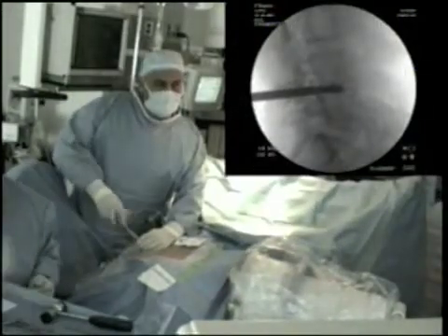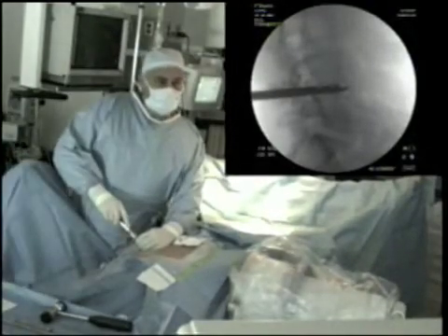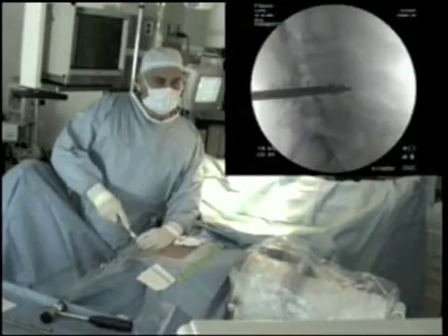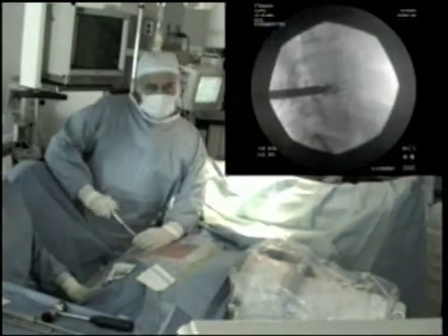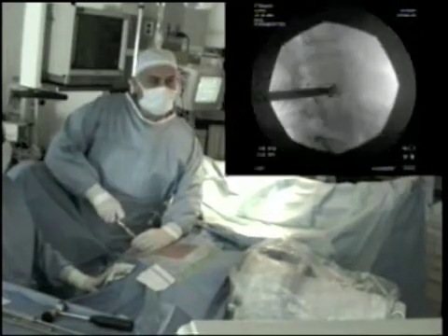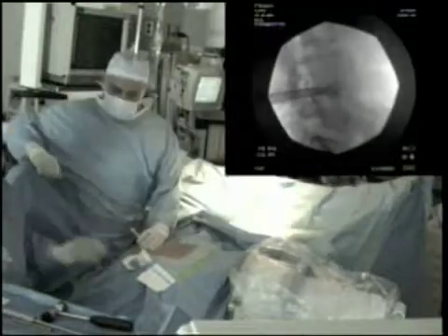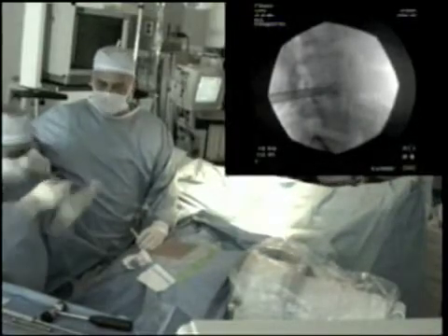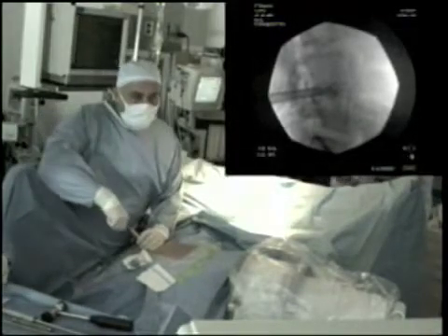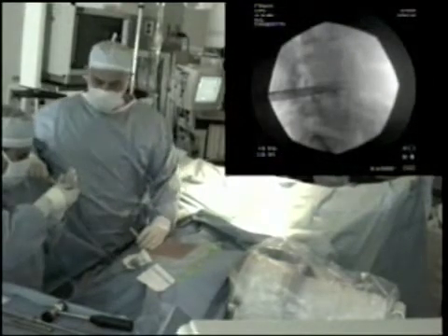A device called a depth gauge is inserted through the sheath to begin the initial central decompression of the disc space. Specialised instruments such as the one seen is called a shaper. This allows further decompression and removal of the degenerated and pain-producing disc material.